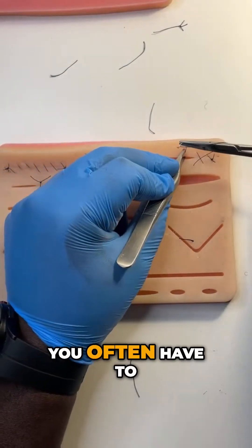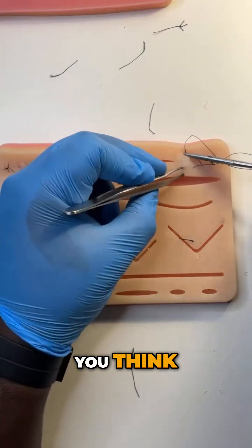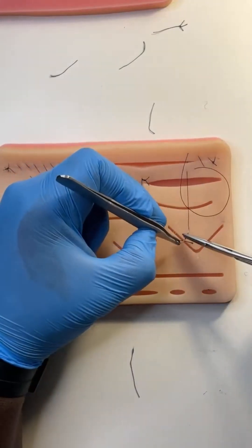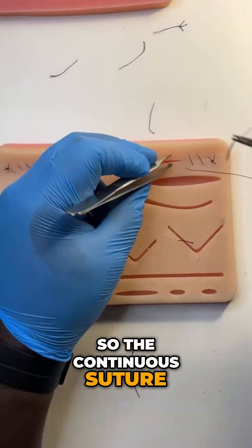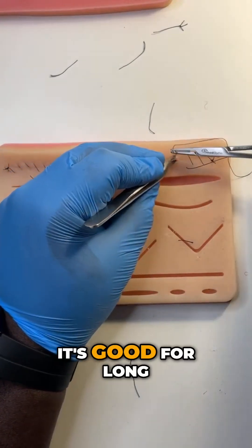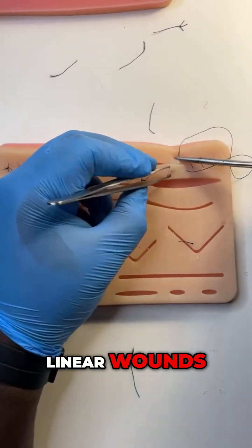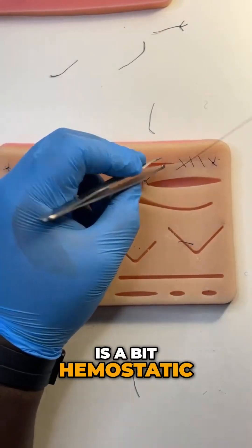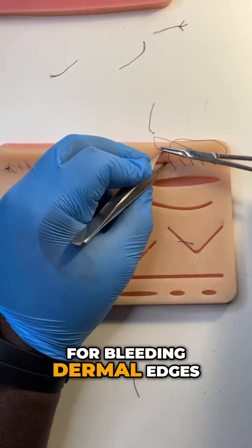You often have to go back further than you think. If you go too close, it will rip out. So the continuous suture is fast, it's good for long linear wounds, and I personally like it because it also is a bit hemostatic for bleeding dermal edges.